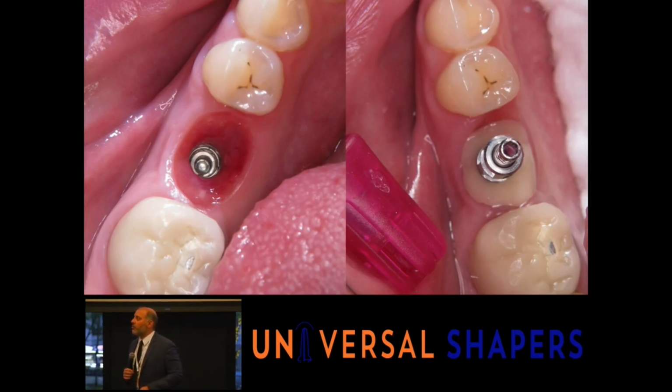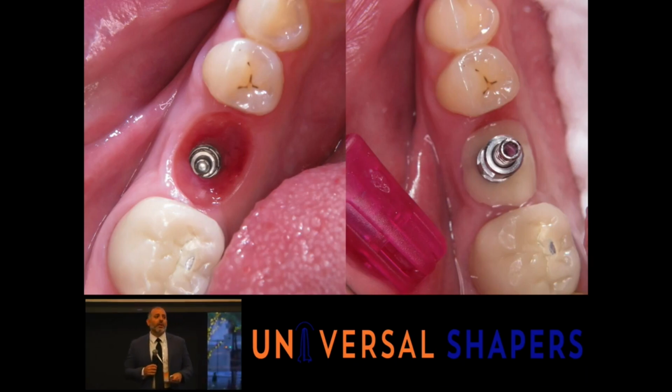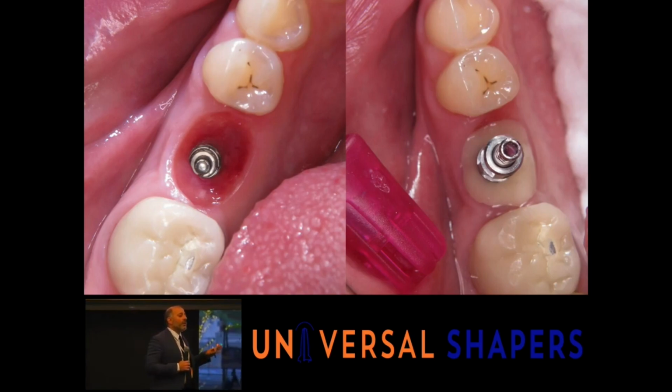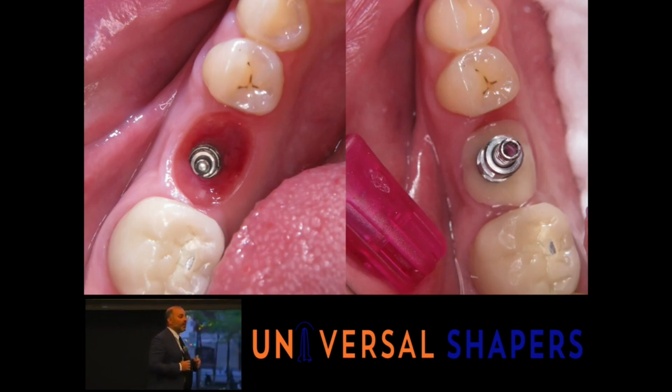So real quickly, just take your transfer. I like to do open tray impressions. Buy the cheapest flowable composite you can find in the market. Flow it around, light cure it, so that while your assistant, or whoever's doing your pouring for your impressions, painting your trays, you can keep that soft tissue stabilized so it doesn't slump. And then you can transfer to the laboratory what's in actuality going on in the mouth. They don't have to make a random guess as to where the soft tissue is going to be. So little cheap way, again, cheapest composite you could possibly find.